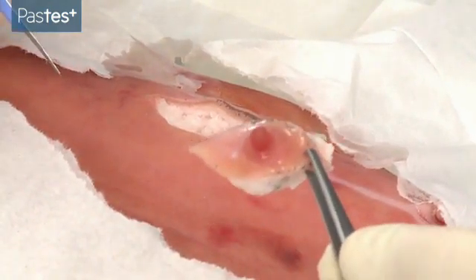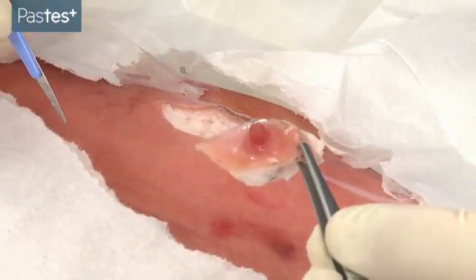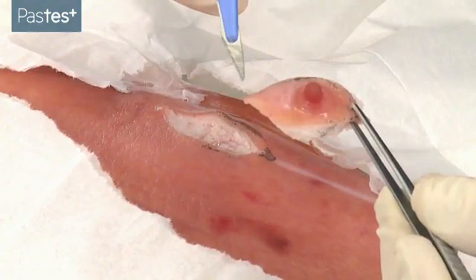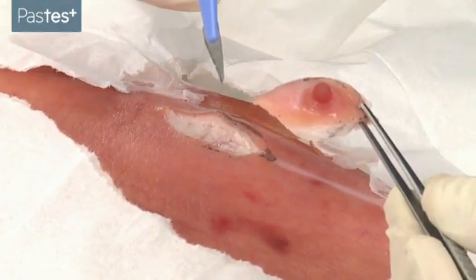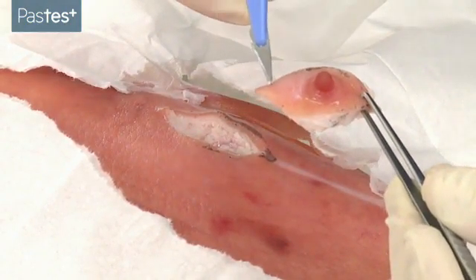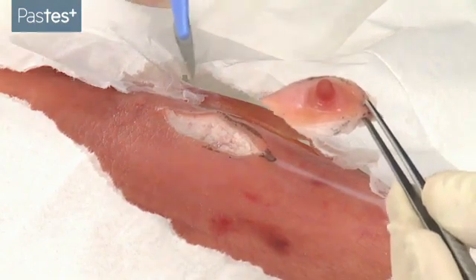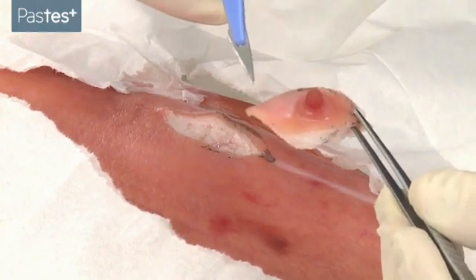Having excised the lesion in full, you need to send it for the appropriate histology. You may, if you wish, place a marker stitch — such as a non-absorbable monofilament — at one end of the lesion, so that you might note, for example, 'marker stitch at most distal or proximal end.' That's entirely up to you.